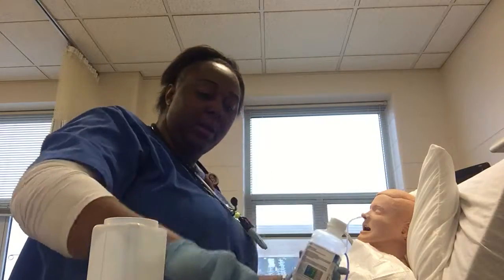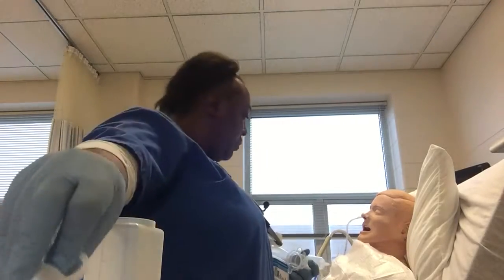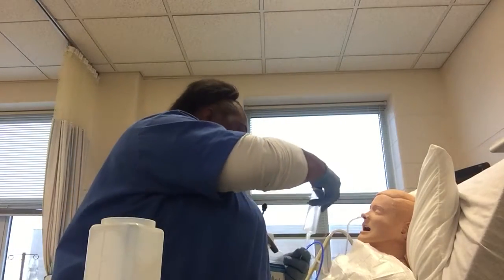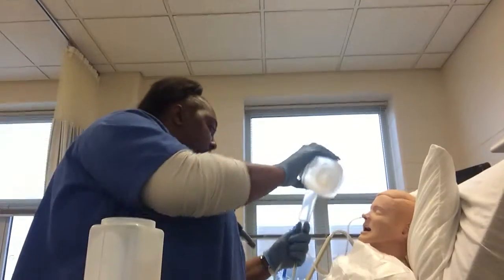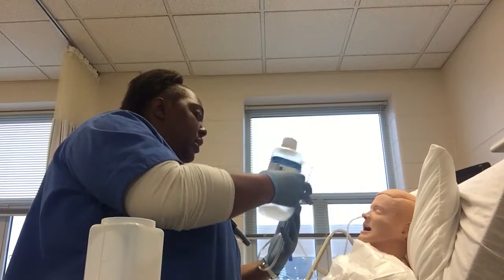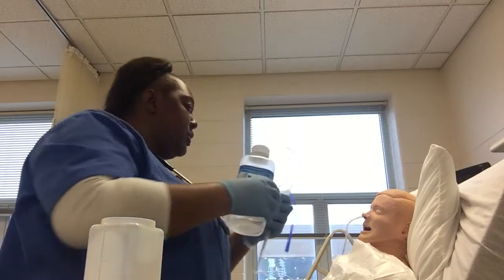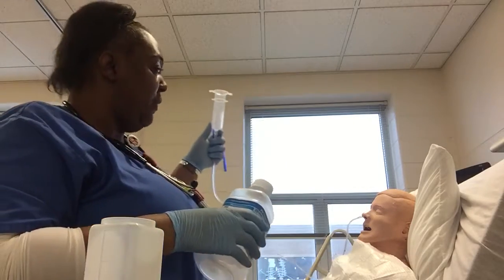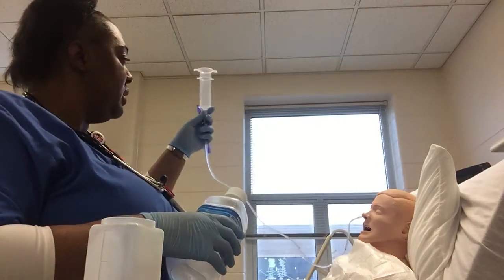and at this point, if I want to, I can have this syringe there, and then slowly pour the Glucerna in there to feed in, letting gravity pull it down so that it's going no more than 18 inches.